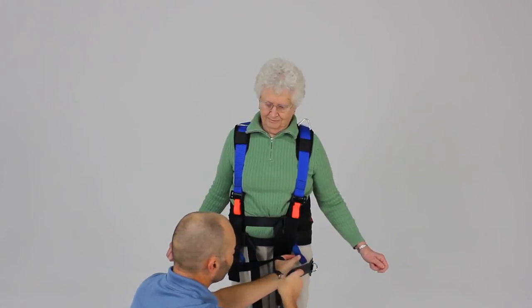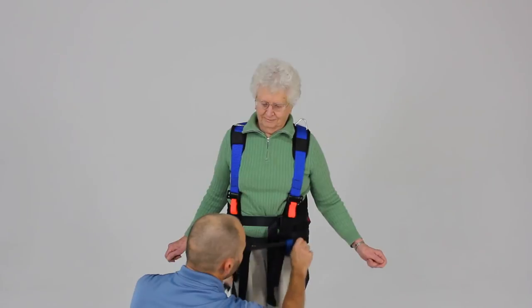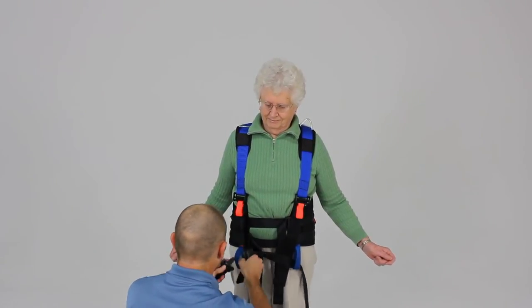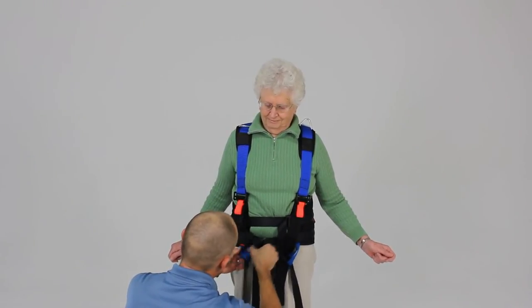Then we take our straps and they're going to go through this blue webbing here. We'll place this one through the blue webbing as well — it kind of holds the support strap in place.